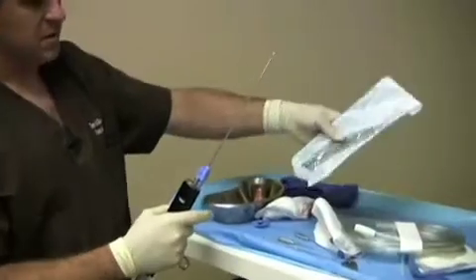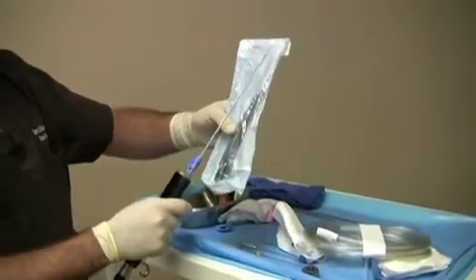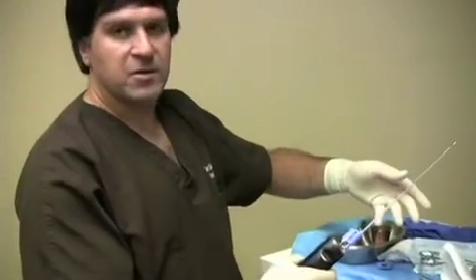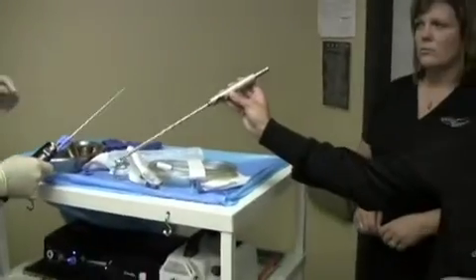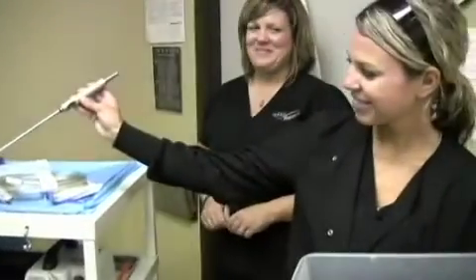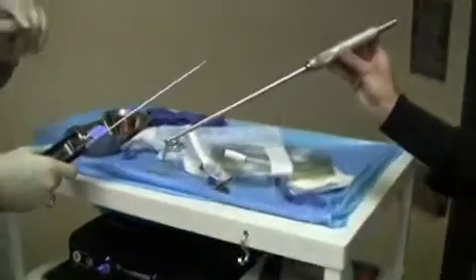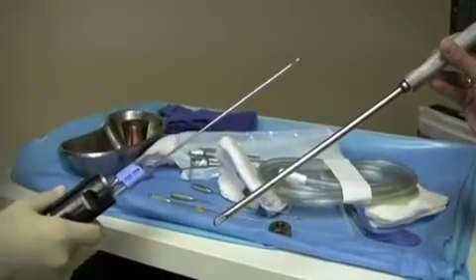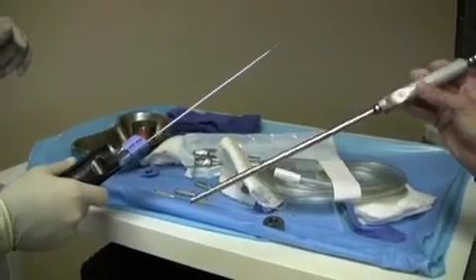The other system that I use is from HK Surgical, which has very tiny cannulas, about the size of the 3mm. Just so you can see, these are really considered micro cannulas. If you look over here, these are very large cannulas, and when liposuction first came about in the 80s, a lot of people used these. Unfortunately, some people still use huge, large cannulas like that, which are prone to cause contour irregularities. It allows for faster extraction of the fat, but we want a smooth result.